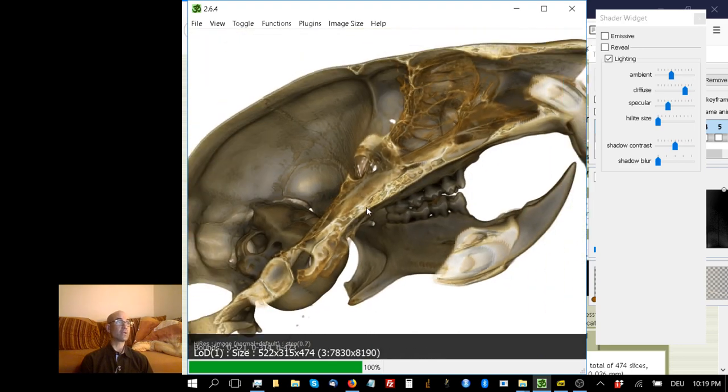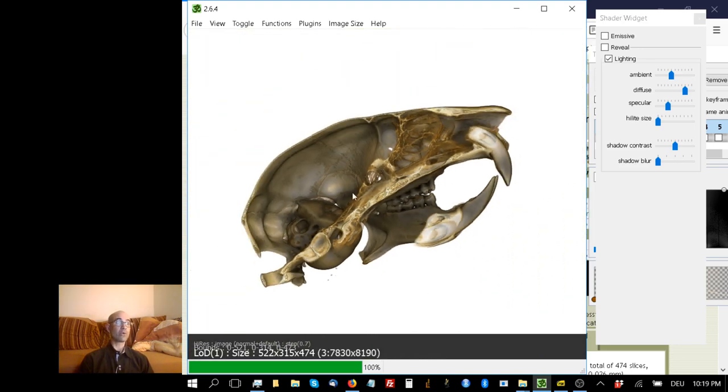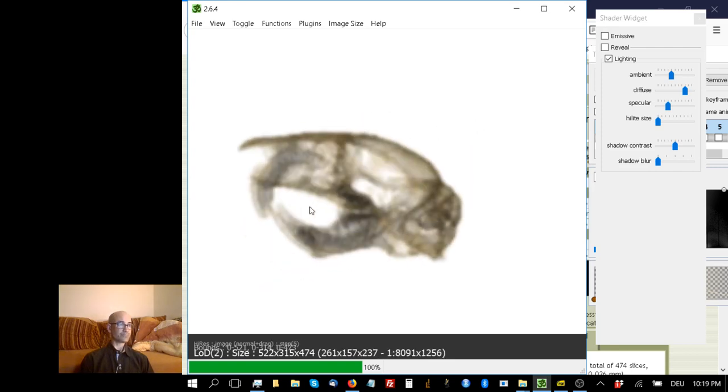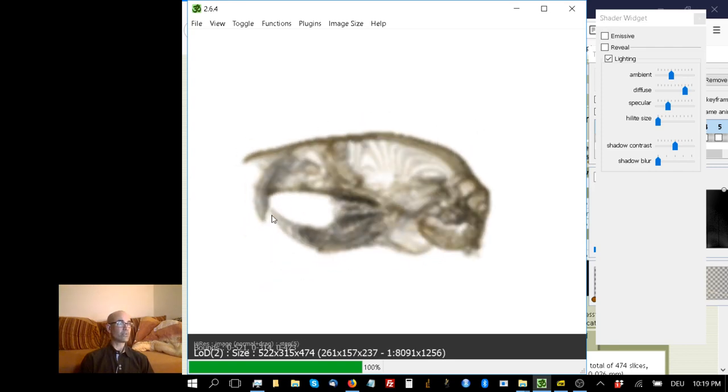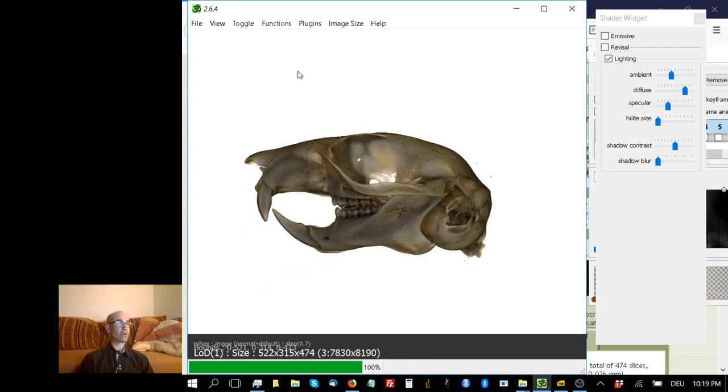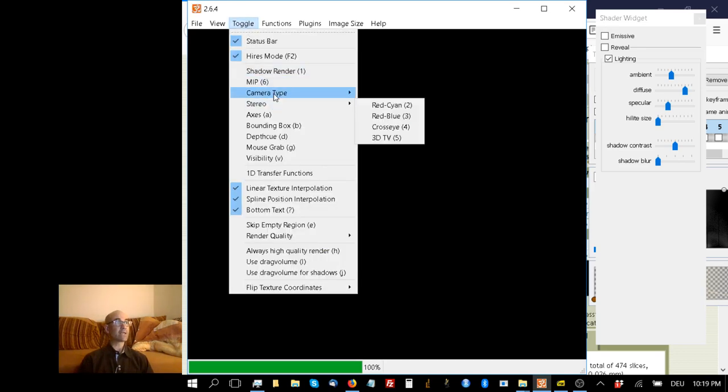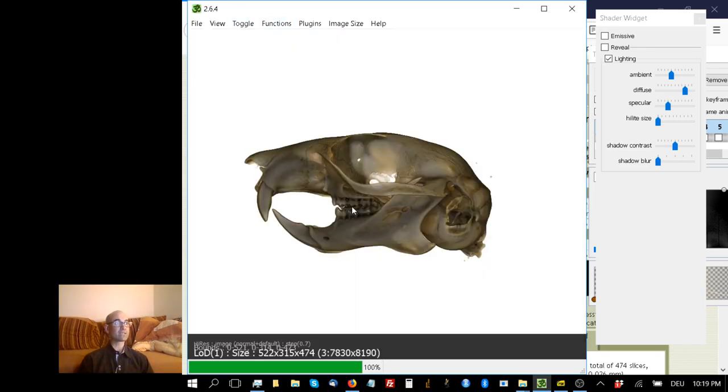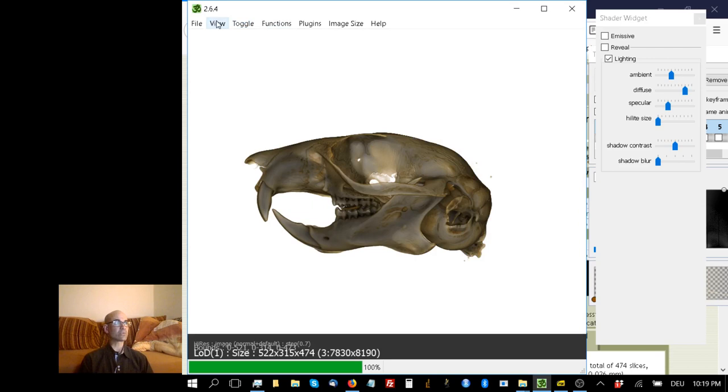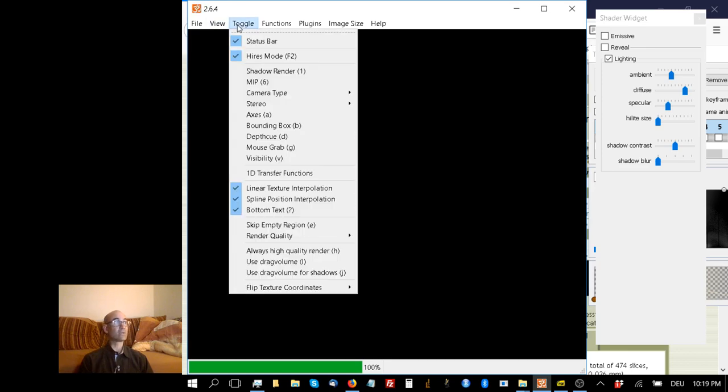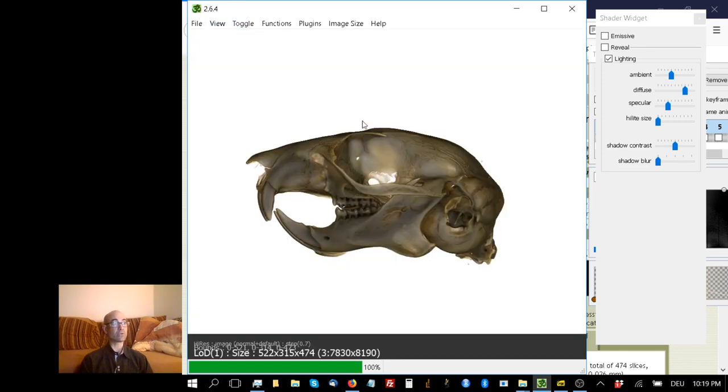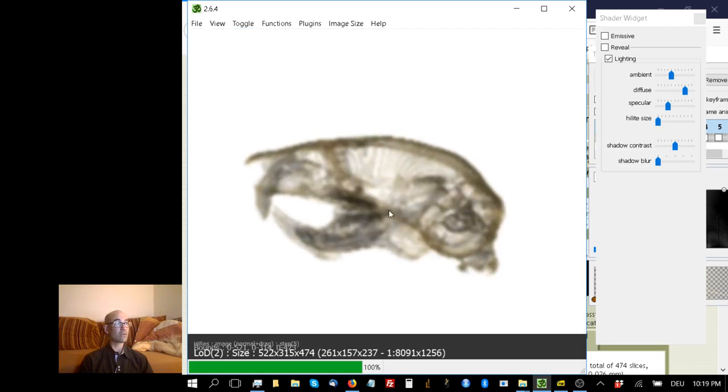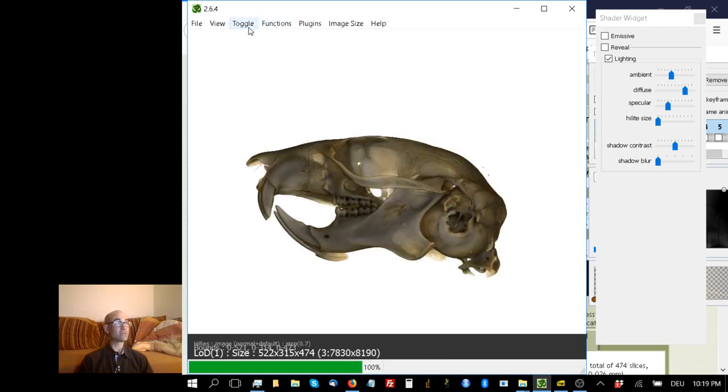Probably you want to measure stuff, right? There are two things worth knowing for measuring. The default in Drishti is to set camera type to perspective, which amplifies a 3D effect. But it's a bit misleading when you want to measure things. I think when you measure stuff or figure something that's measured, you should do camera type orthographic.